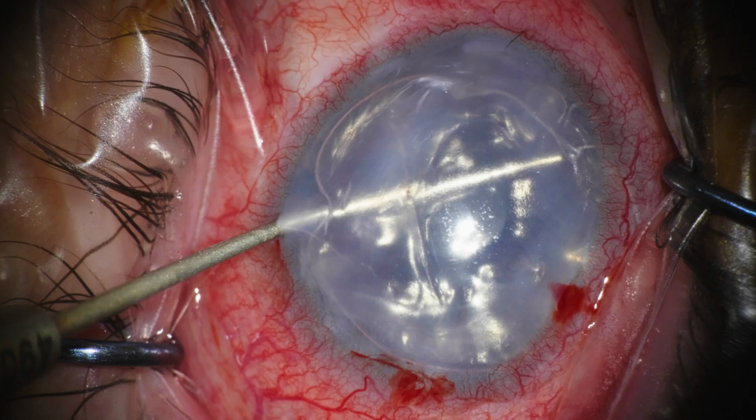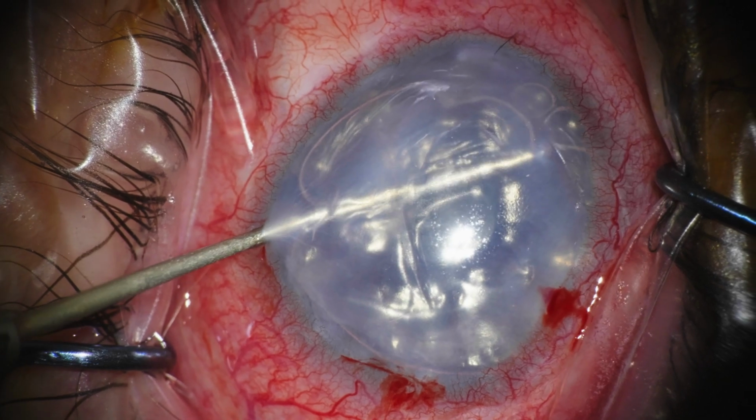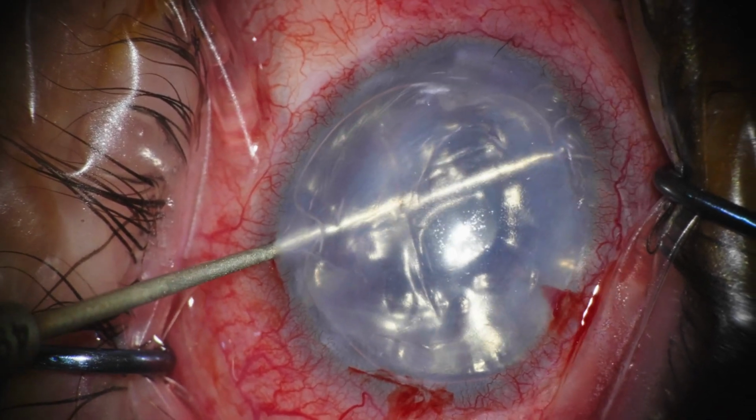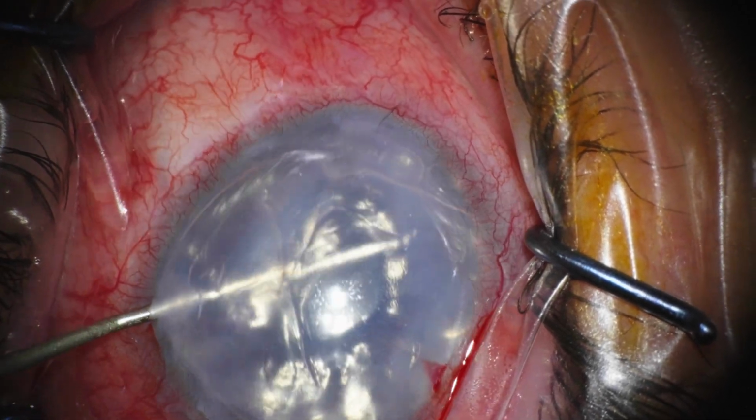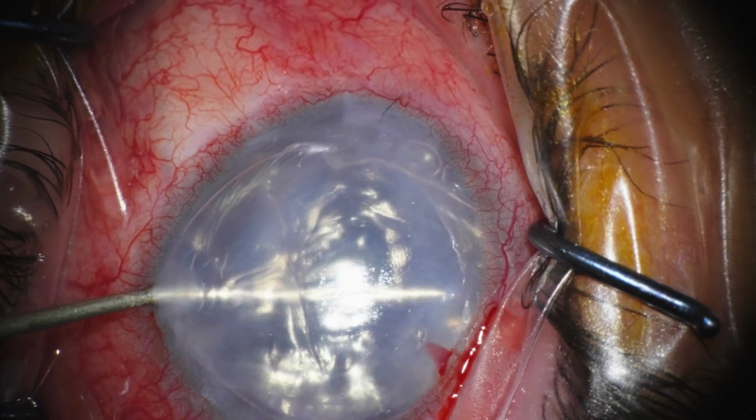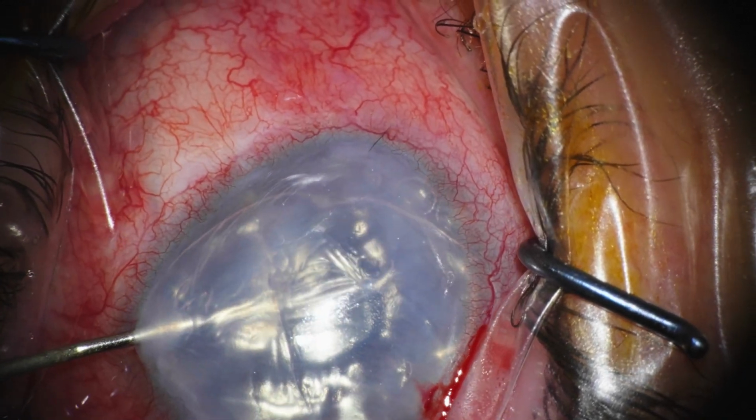And because of the endothelial decompensation, we did a DMEK for him 6 months ago, and then he developed a rapidly evolving cataract, which we had to operate on fairly quickly, about 3 weeks after the initial DMEK. And because of that, that initial DMEK failed. And now we're back in the operating theater with him under general anesthesia doing a re-DMEK. And we're doing a re-strip here under air. And you can appreciate the pretty advanced corneal haze.